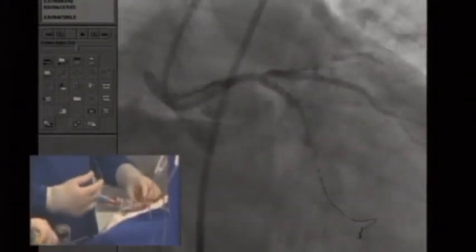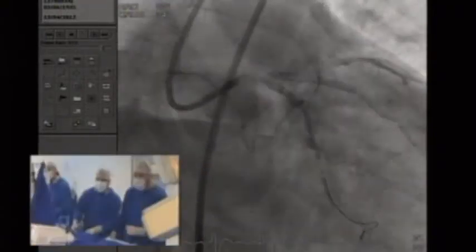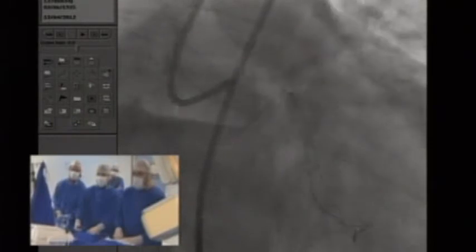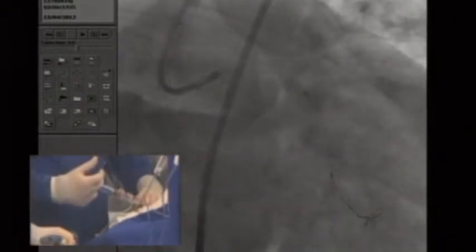Yes, Alex, because the patient refused surgery. She's a 75-year-old lady with multiple disease, some long lesions, but some of them quite focal. If the case is quite complex, we should be aware of the amount of contrast for this lady. Alex, tell me something because I can't hear you. I don't know if you're hearing us, but we lost the audio.